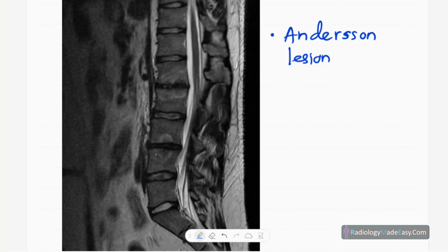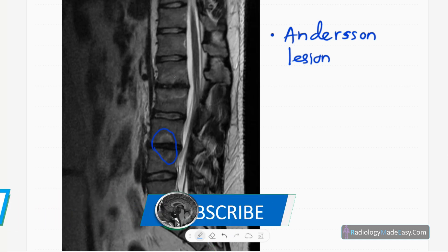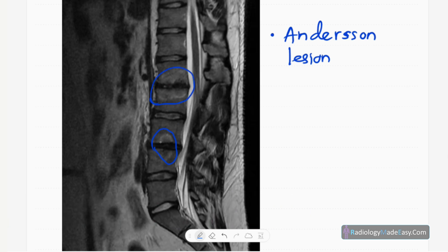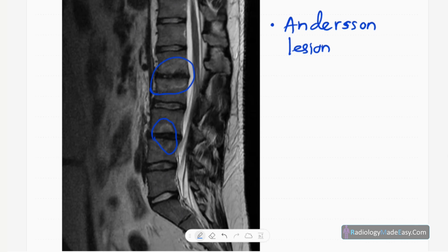On T2-weighted MRI, you can see hyperintense areas in adjacent vertebrae. This is a non-infectious spondylodiscitis, also called an Anderson lesion. There is intradiscal herniation of the nucleus pulposus into the vertebral body, appearing similar to a Schmorl's node — a spondylodiscitis occurring in ankylosing spondylitis that is not infectious in origin.